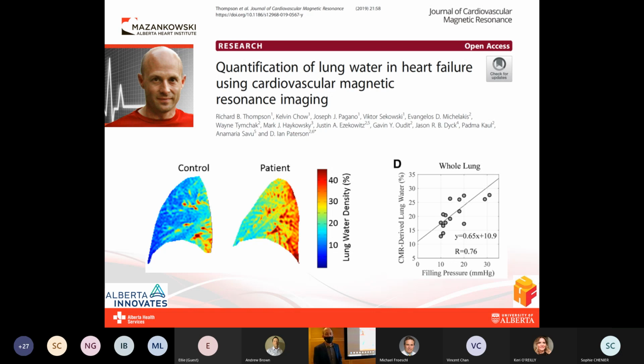We had a discussion, can we develop MRI to image the lungs while we're doing these cardiac scans on patients to quantify the amount of pulmonary edema that they have. And so he developed a very simple, 3 to 5 minute non-breath hold scan that we could add to the MRI while the patients are being scanned to complement all of the other myocardial information that we're getting.